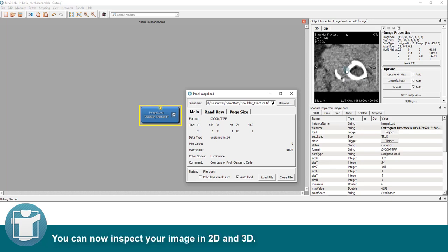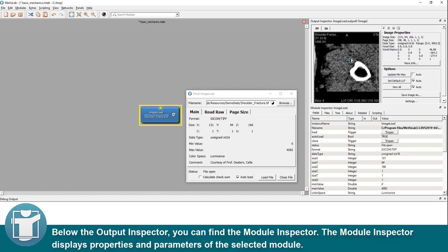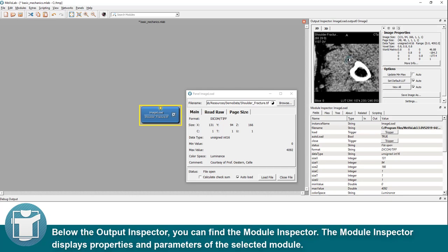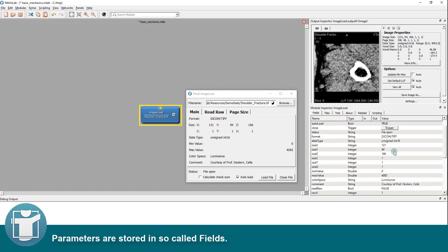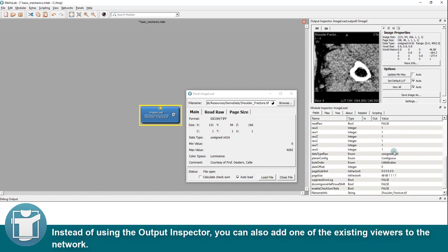You can now inspect your image in 2D and 3D. Below the output inspector, you can find the module inspector. The module inspector displays properties and parameters of the selected module. Parameters are stored in so-called fields.